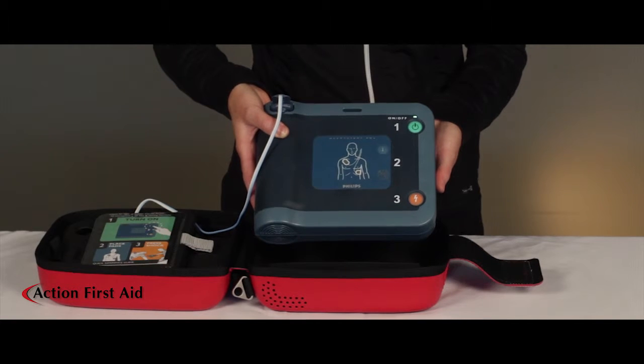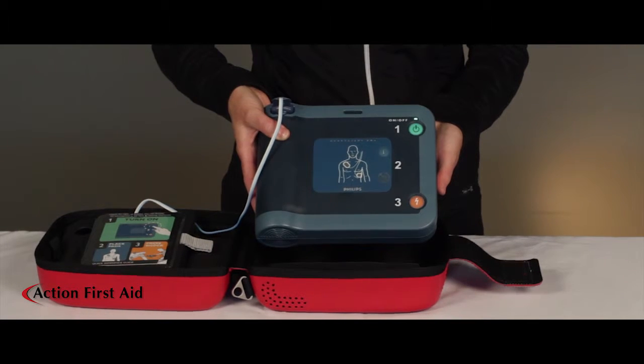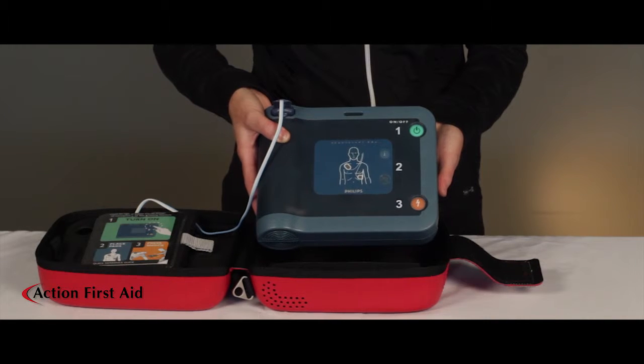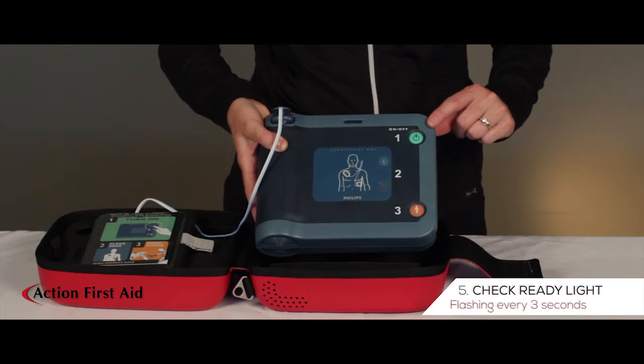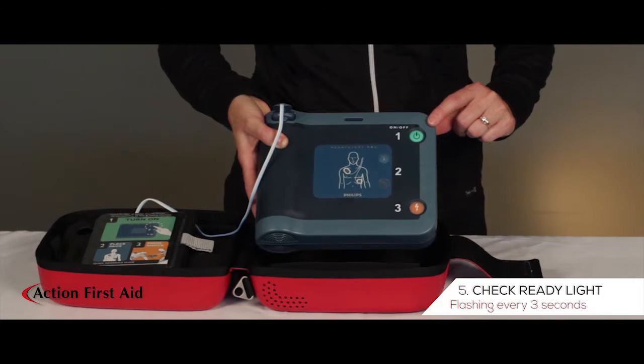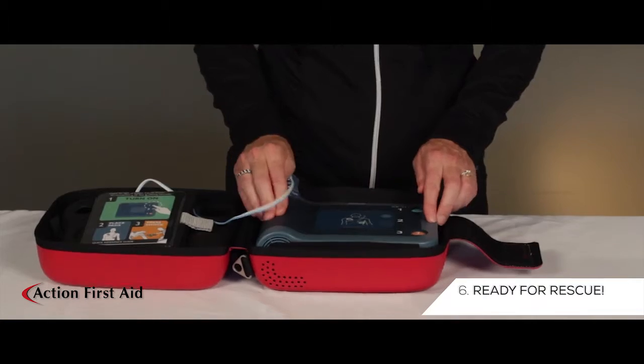Testing. Ready for use. After the self-test has been completed, check to make sure that the green light above the power button is blinking every three seconds.